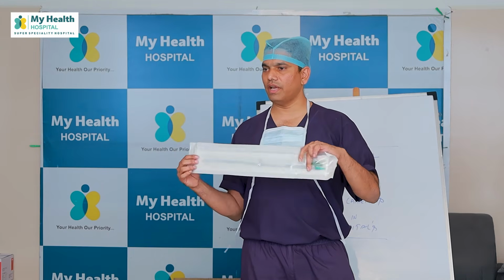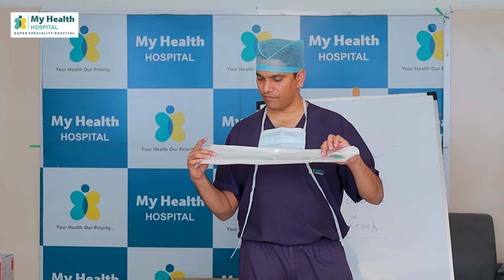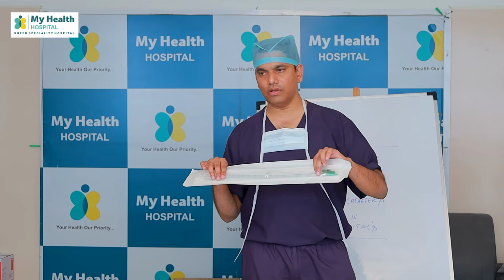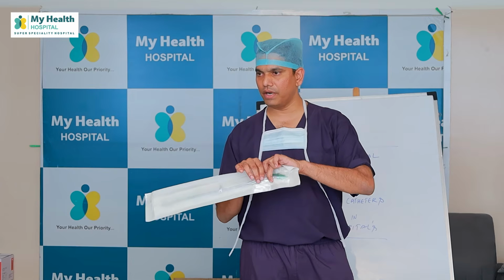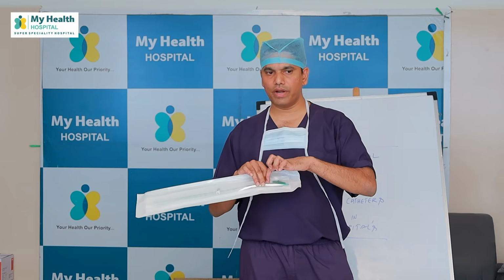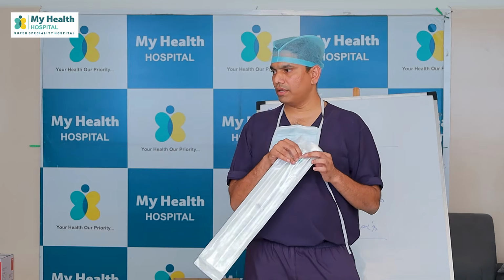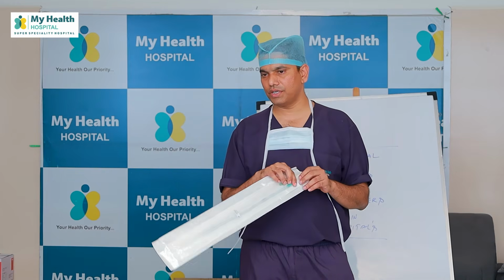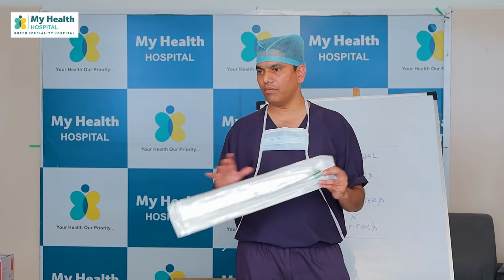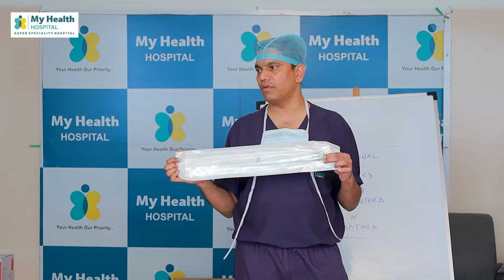This end is free. When we have an abdominal drain, we have the same hole, same lumen caliber, material and everything is the same, but we have an open end on this side as well. For this abdominal drain, we'll get a connector. That is the difference between a chest drain and an abdominal drain. Abdominal drain is open on both sides. Chest drain is closed on one side.